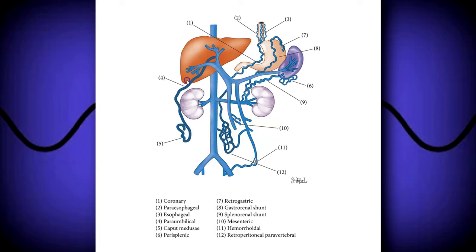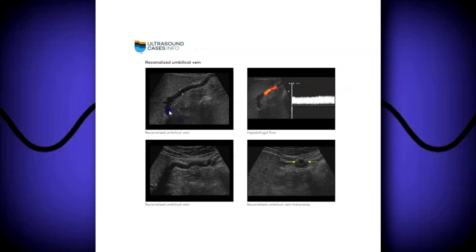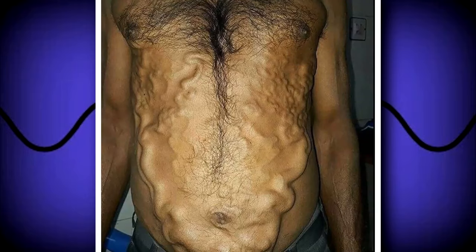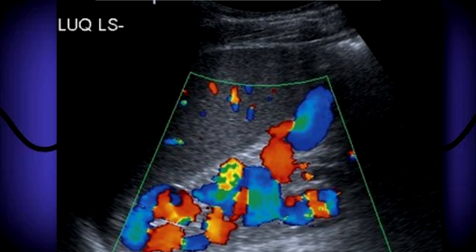Collaterals can form in many places: the gallbladder, spleen, esophagus, stomach, subcutaneously — the caput medusae sign — and can lead to life-threatening variceal bleeding. Among the collateral pathways are the caput medusae, esophageal, gastric, splenic, and splenorenal varices. Here is a case of a recanalized para-umbilical vein — the ligamentum teres in the sagittal plane will be dilated and fill with flow on color and pulse wave Doppler. This is what the caput medusae sign looks like: multiple varices under the skin surface. Here is a spleen with multiple varices at the splenic hilum.